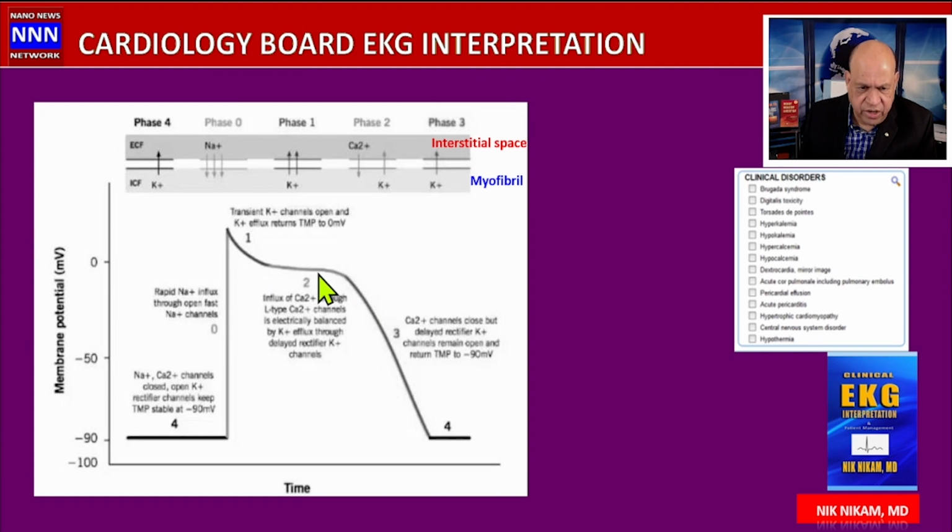And since these are involved in the ST and T wave segments of the electrocardiogram, the changes that affect the EKG by changes in potassium and calcium will be shown predominantly in the ST-T segments and also the QT interval.